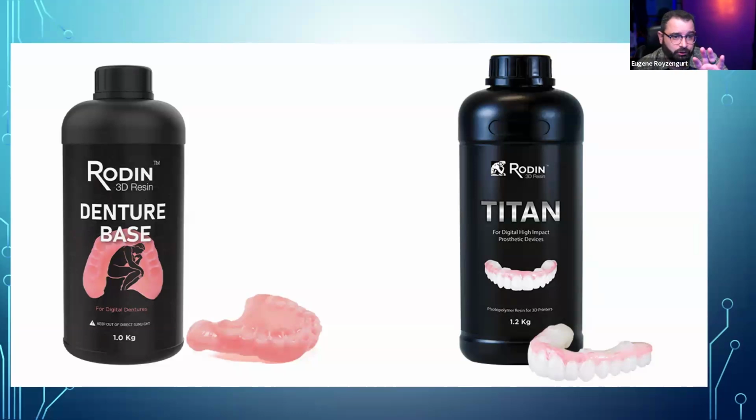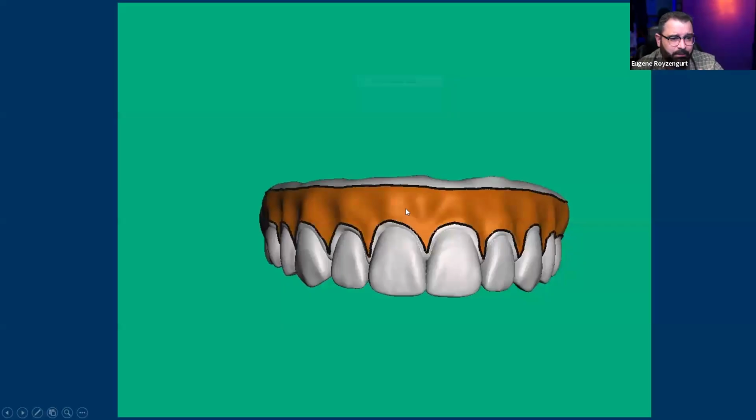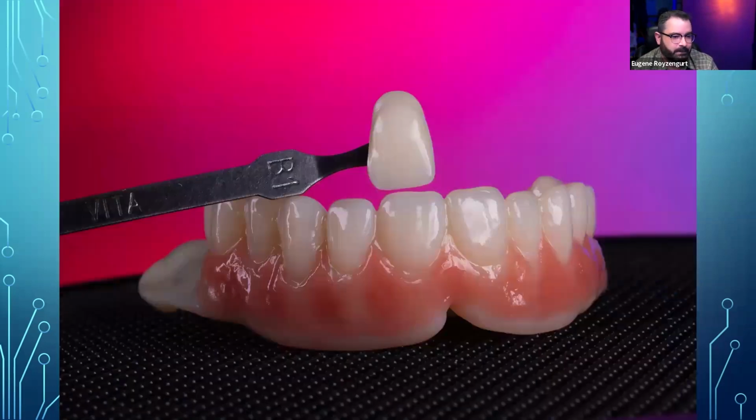Now, you can do that this way, or if you don't want to do it this way, you can just print monolithic with the cutback as I show you right here. Usually I do my cutbacks in Meshmixer like this, and it just works really well. And then you can make it beautified like this for temporary. It's up to you guys. There's many ways to do it, okay?